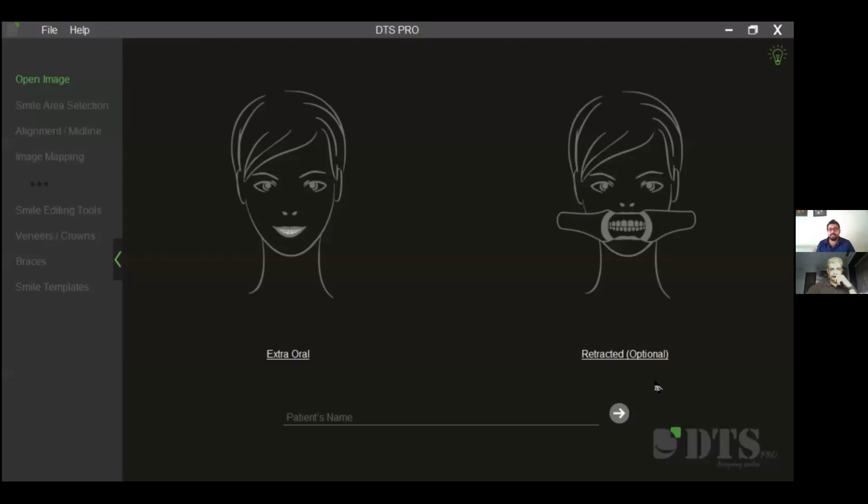Now the question which I came across very frequently is, doctor, can you just show me how I will look after treatment? What we typically do is take some models, maybe show some before and after pictures from the internet of cases which we have already treated. And we flash it on the screen, or many of us still use a pen and a pencil to show how those gaps would close. So there are different ways of communicating with the patient. But then I realized the patients wanted to see how they would look, rather than how somebody else is looking after a particular treatment is carried out.